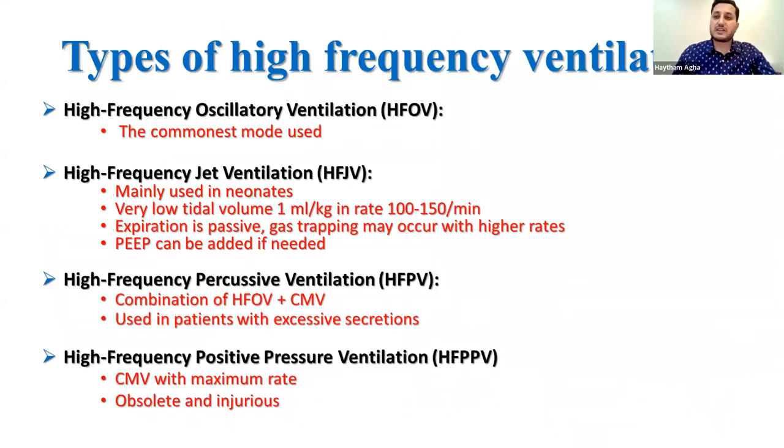Let's talk about the types of high frequency ventilation that can be used in our field of practice. First of all, high frequency oscillatory ventilation, and this is the most common, and we'll spend the whole lecture talking about this mode in detail.